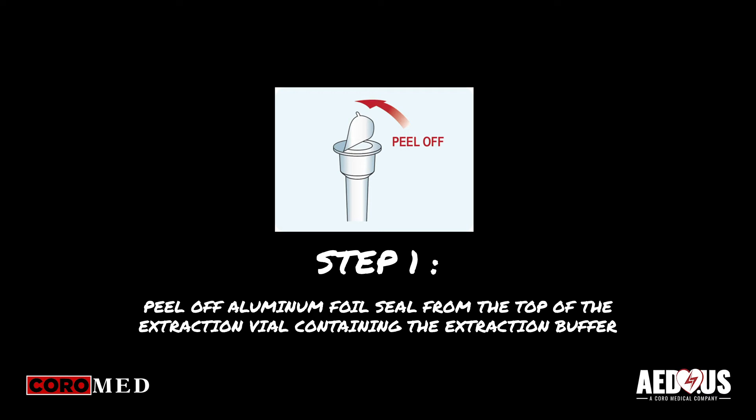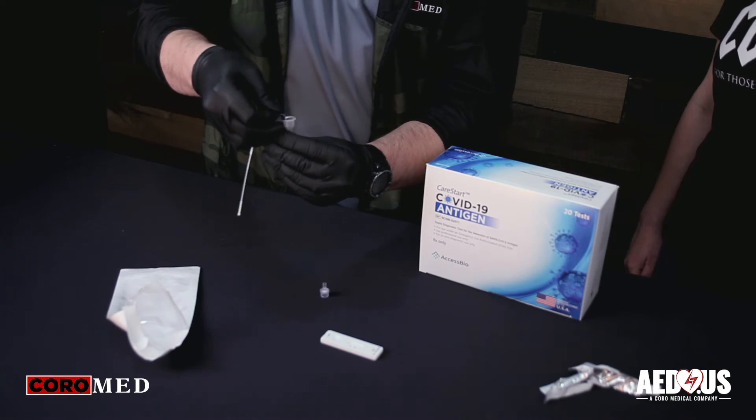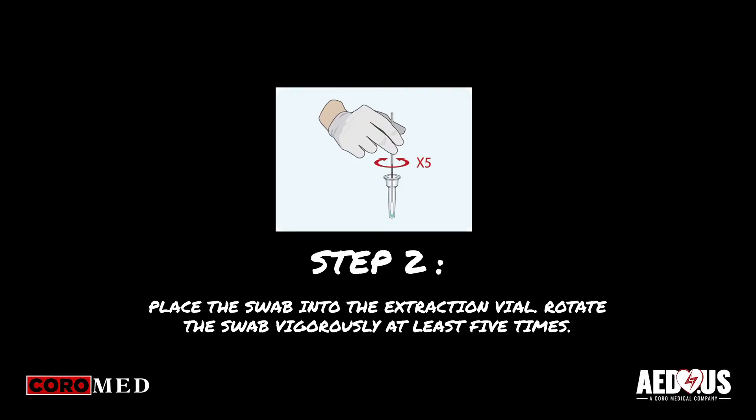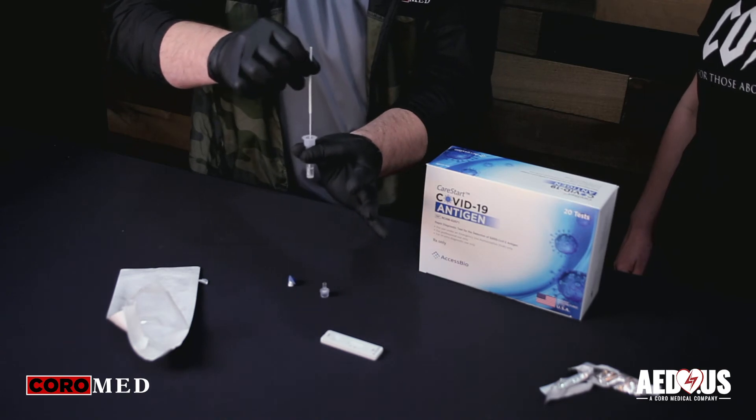Once you have administered the test, you will now need to get the extraction vial and cap. Peel off the aluminum foil seal from the top of the extraction vial containing the extraction buffer. Place the swab into the extraction vial and rotate the swab vigorously at least five times.